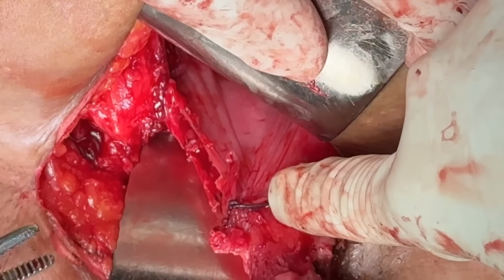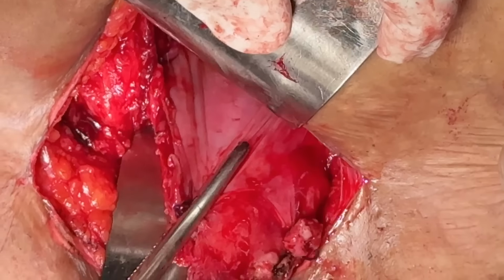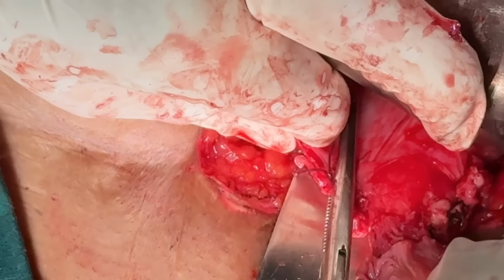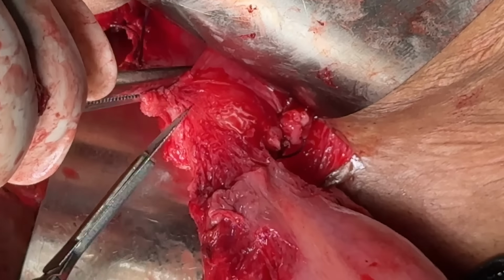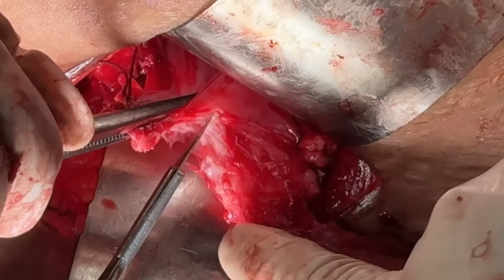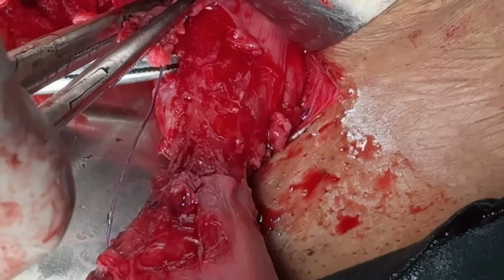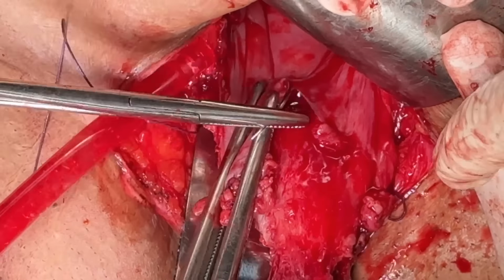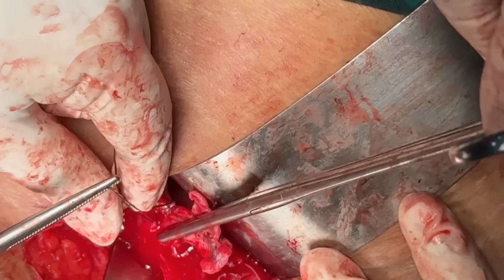Remember, any hysterectomy you might be doing, the next pedicle should always be medial to the earlier pedicle. So this is the clamp which is medially put to the uterine artery pedicle. You can see it is medial to the knot, and you have to clamp the uterosacral properly here. Once clamped, you can cut it with the help of a knife, taking a bit of cervical tissue in the clamp so that the fixation is better. Uterosacral ligaments will later be used to tie with the vault to prevent vault prolapse.